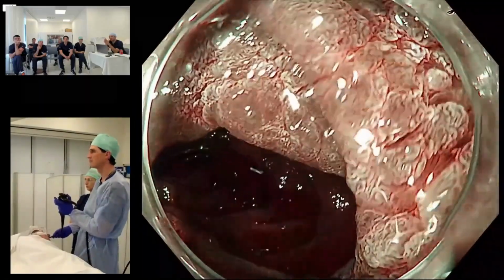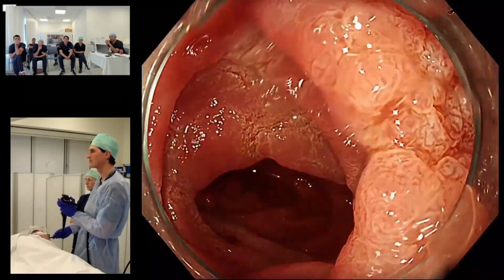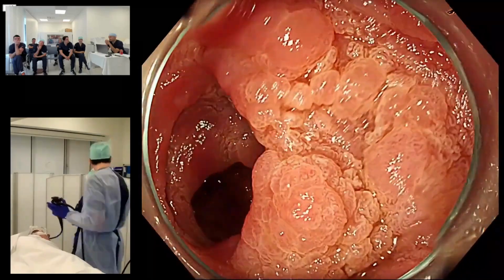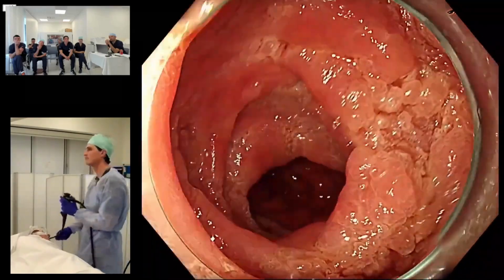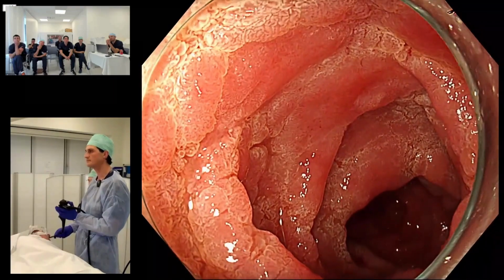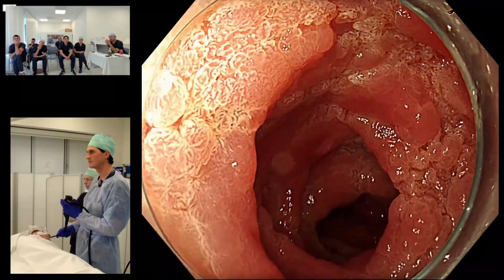That white that you see, very standout white on narrowband imaging, very flat, like hugging the mucosa. Also it's quite bile stained, which they sometimes tend to be. So you see that there's kind of that yellow all over it. That's just bile that's staining the thing. There are areas within it which are not the same. So you have the two morphologies of duodenal polyps within it. You have the kind of red flap and the white flap. I don't think that means anything.